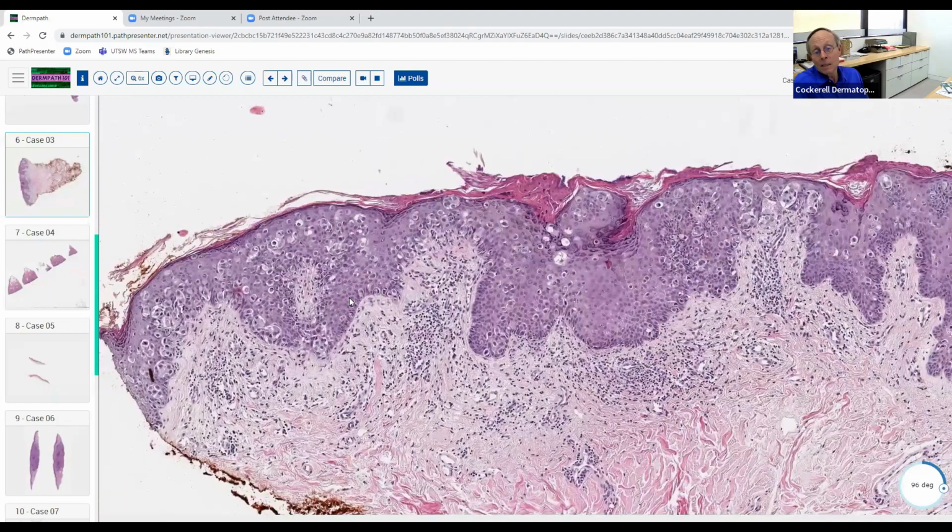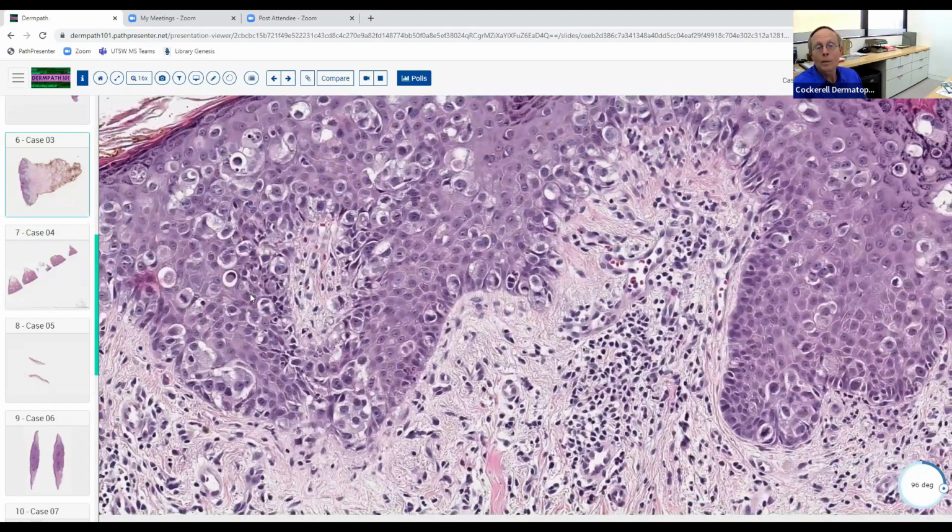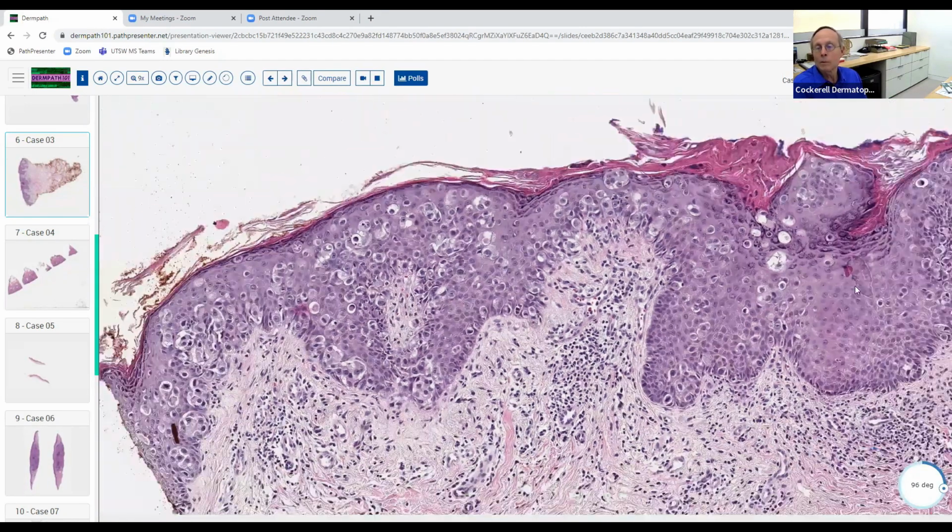But it's kind of interesting to know that there are two different sources of mucin in the body. One that's from the epithelial cells, like your GI tract, salivary glands, et cetera. And then one that's from the fibroblasts, and some mast cells and histiocytes also produce that mucin.